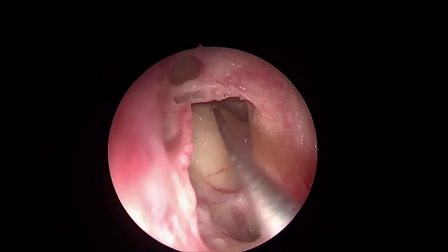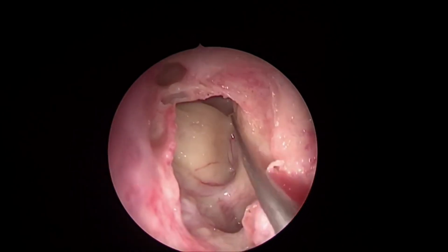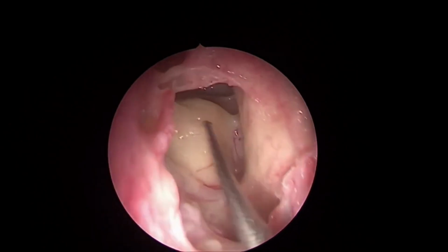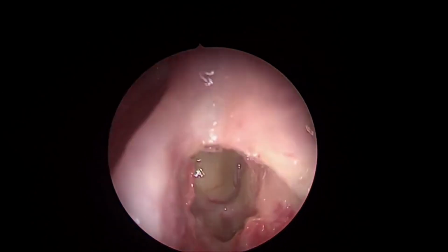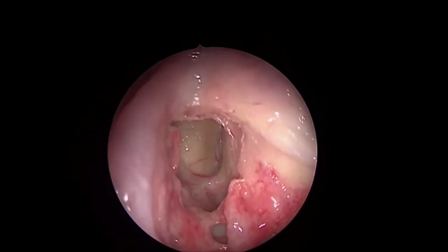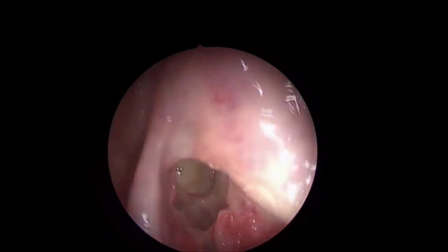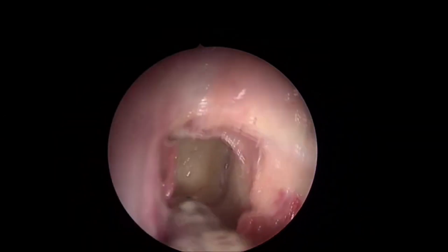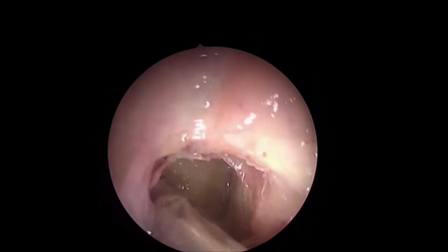So those cells which are on the posterior wall of the frontal sinus outflow need to be opened from anteriorly and flush with the posterior wall rather than going behind them. And this discrimination, you have to plan. You cannot know unless you have a good understanding of the CT scan, which you can do yourself by means of a 3-dimensional CT scan on a DVD. In that situation, you can get to know very easily which cells are anterior, which cells are posterior, and you can literally get them out.